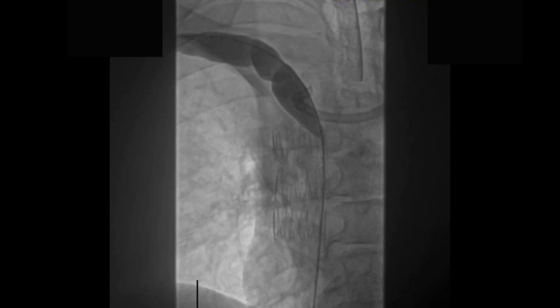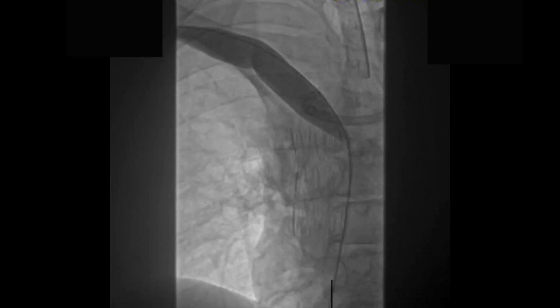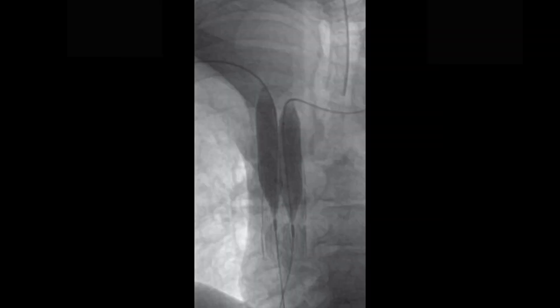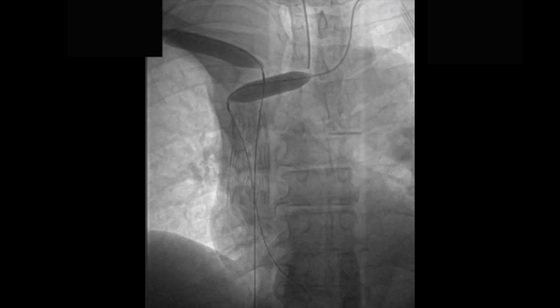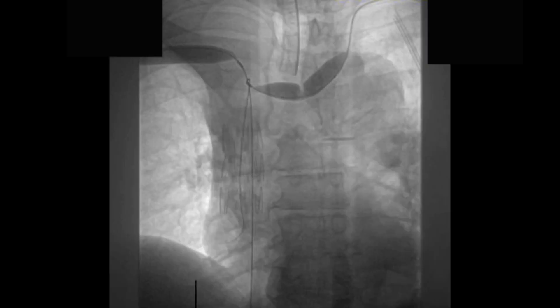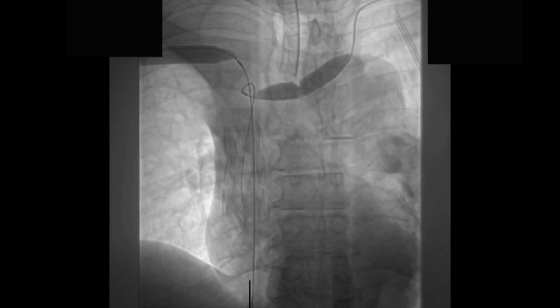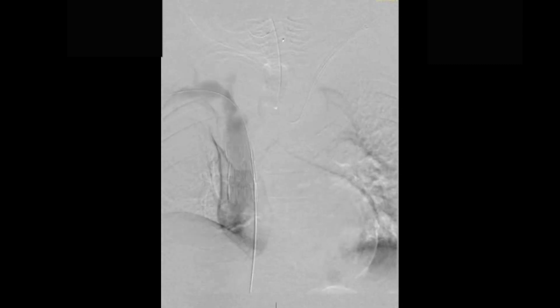On a completion venogram, we were able to see that the previous stenotic SVC is now fully patent, but there was some persistent stenosis in the brachiocephalic veins as well as the right subclavian vein. So we performed balloon angioplasty of the right side with improvement of the stenosis, then removed the left IJ TDC that was in the right brachiocephalic vein and performed angioplasty of the left side as well, continuing to the left brachiocephalic and left subclavian veins with good results, as seen on the completion venogram showing very little reflux into the previous collaterals.